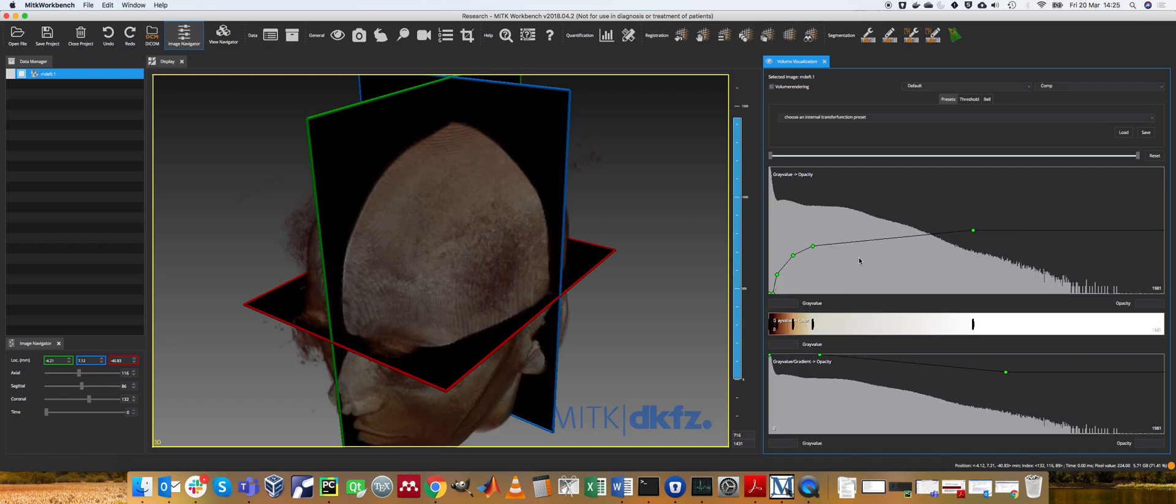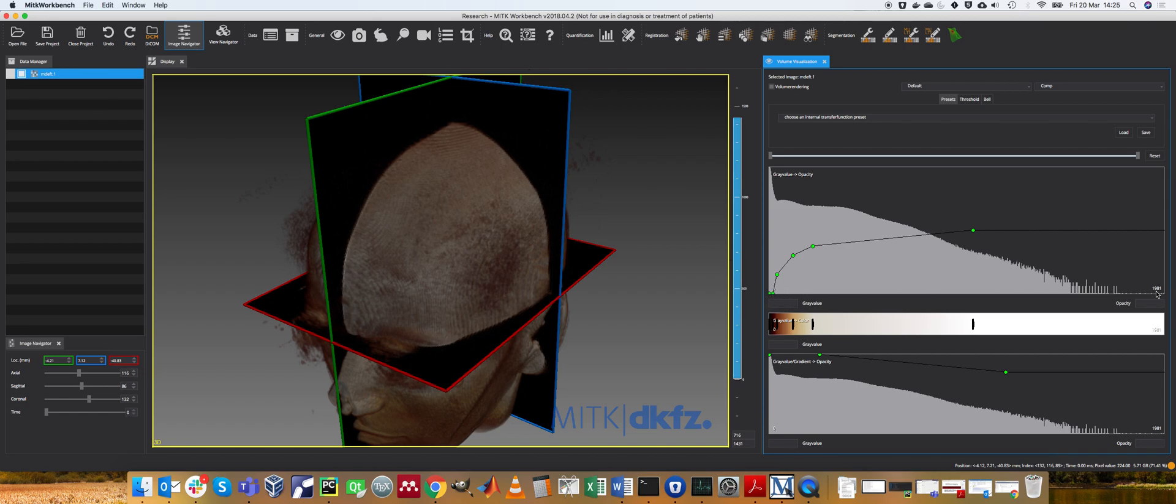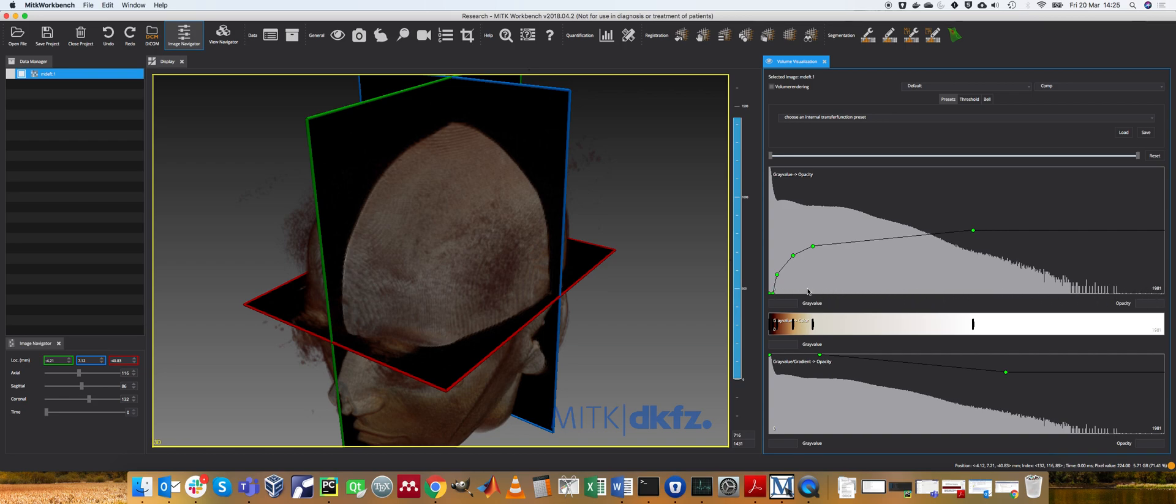This is achieved typically with a certain number of transfer functions. If you look at this graph here, the minimum value on the x-axis is zero and the maximum value is 1981. So this is the range of image intensities in my volume data, it's the gray scale of the MR data.